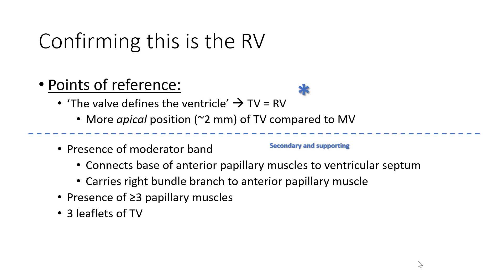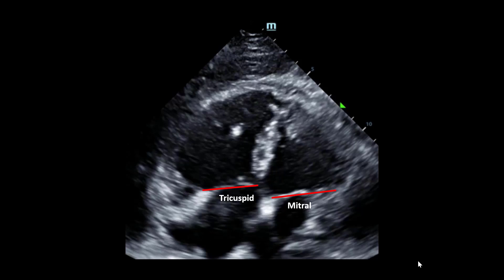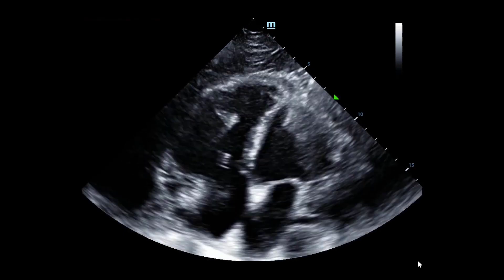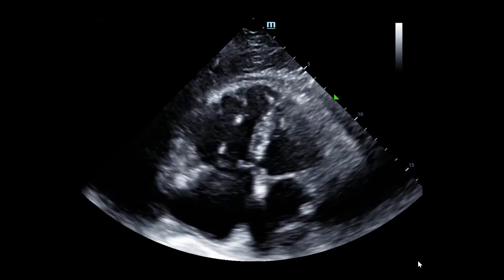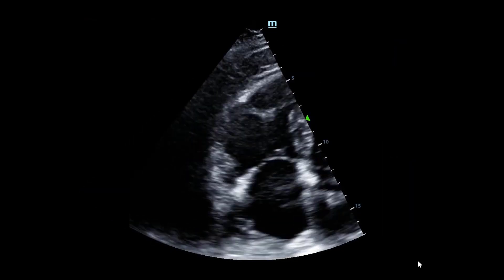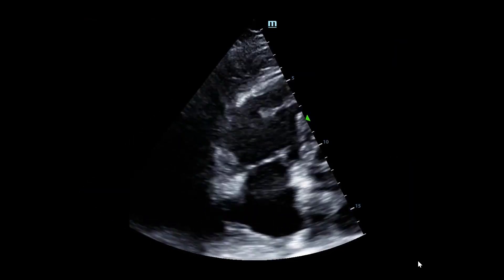Our key learning point is that the valve defines the ventricle — specifically, the more apical position of the tricuspid valve compared to the mitral valve. Secondary and supporting criteria for more advanced echo include the presence of a moderator band, greater than or equal to three papillary muscles, or three leaflets of the tricuspid valve. Both the right atrium and left atrium appeared dilated, suggesting this could be more of a chronic process. Here is a more RV-focused view of the apical four chamber.